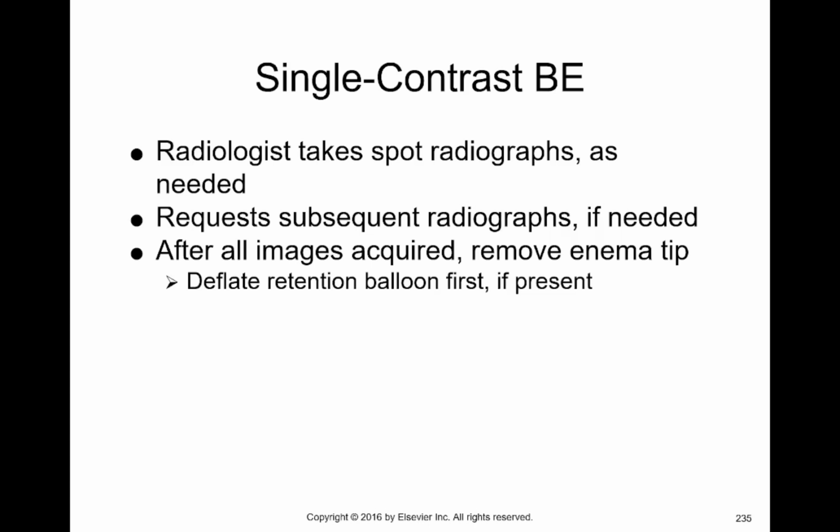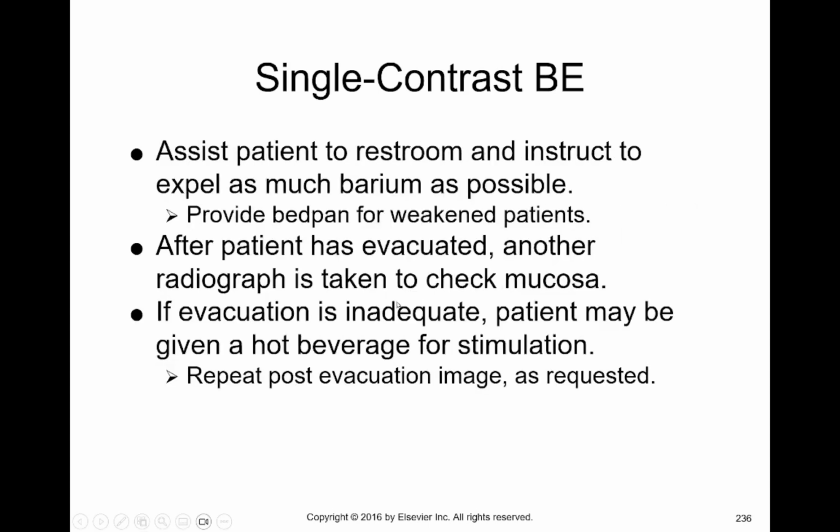So be familiar with your doctor's protocols and make sure that you follow those protocols, but also listen as the doctor leaves the room so that you know what they want. Sometimes they'll ask for a limited series. So what you're going to do is leave the retention balloon inflated, and you'll perform your exam, and that's what will follow here.